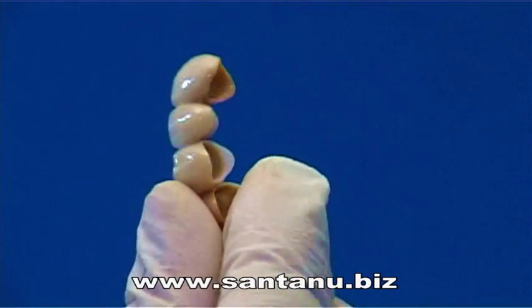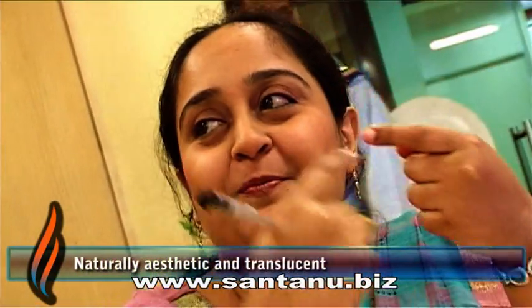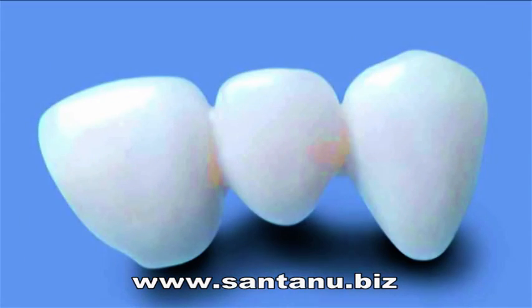Needless to say, they have an unmatched natural aesthetic and are translucent like the look and feel of natural teeth. Available in single crown to full arch of 14 unit bridge, with every unit crafted with impeccable accuracy.